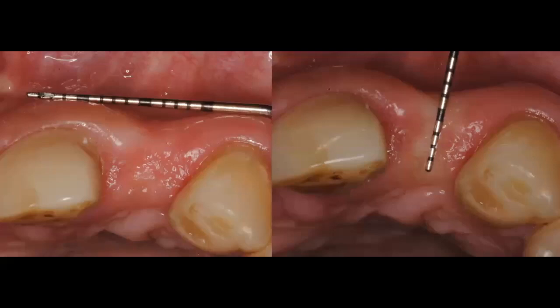or the edentulous site. And as you can see in the photo on the left-hand side and the photo on the right-hand side, the patient presented with a fairly large bony defect in that site, and we were thinking that maybe the buccolingual width of the bone was not going to be ideal for us to be able to place an implant.